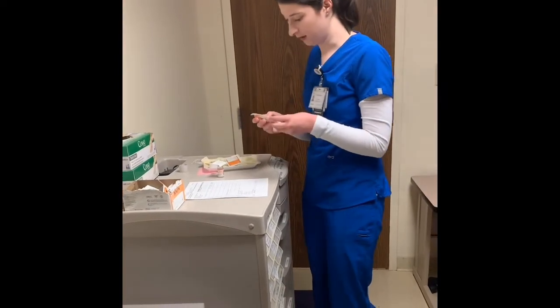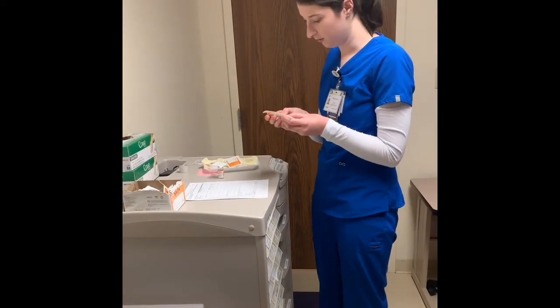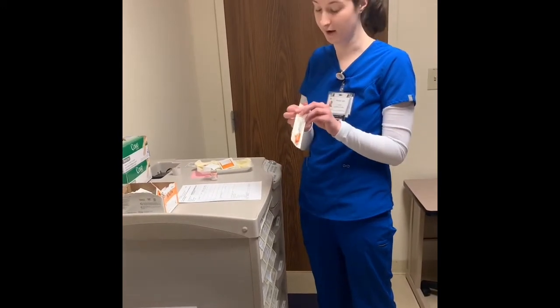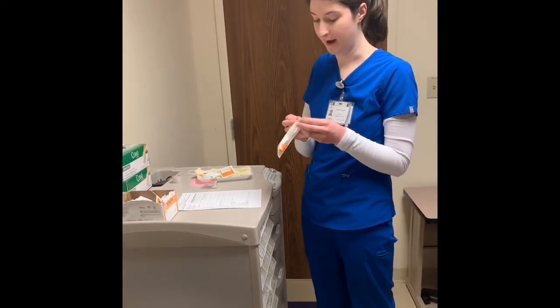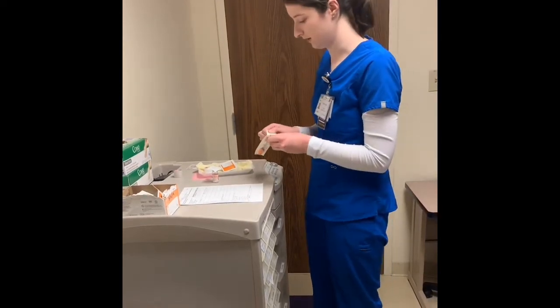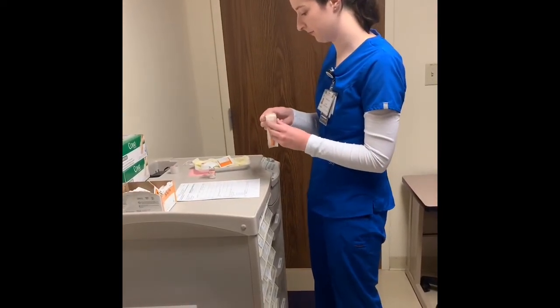And just to double check, this needle does not expire until 6/30 of 2023, so it's not expired, and the packaging is intact, it's unopened and undamaged, so it is safe to use this needle. So I'm going to go ahead and open it up.